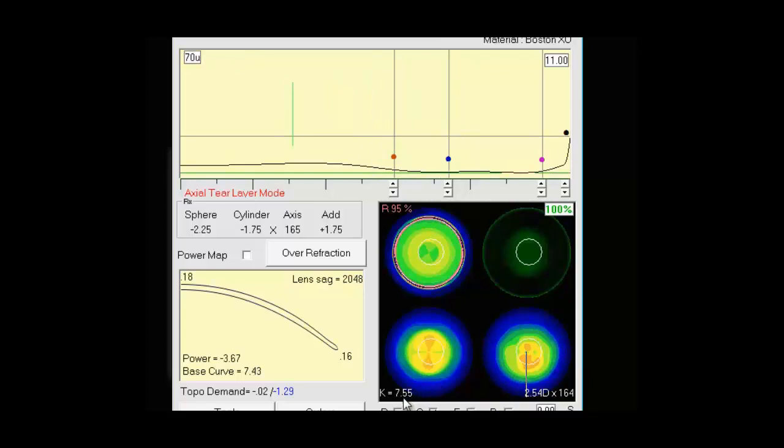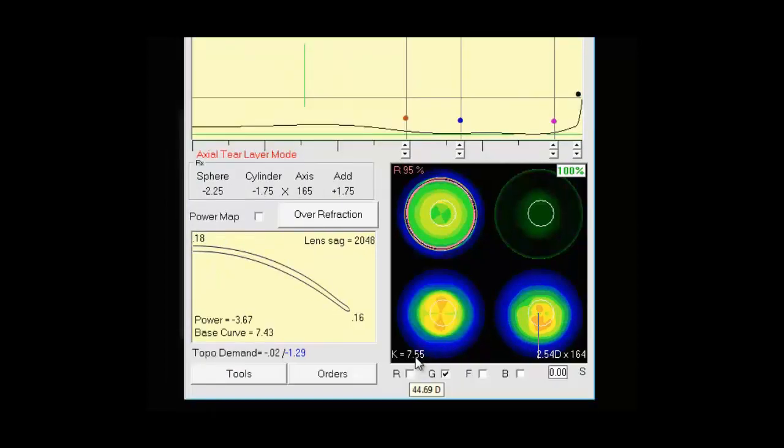In the lower left we have K equals 755. That's the average K. And if you hover over it it will show you in diopters as well. And on the lower right we have the corneal cylinder. These are great references to have as you're designing your lens.